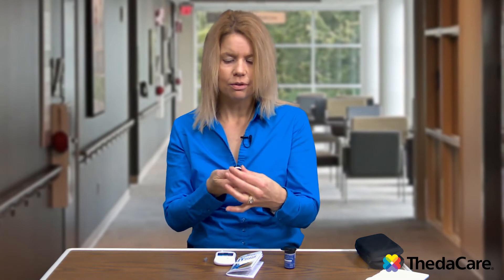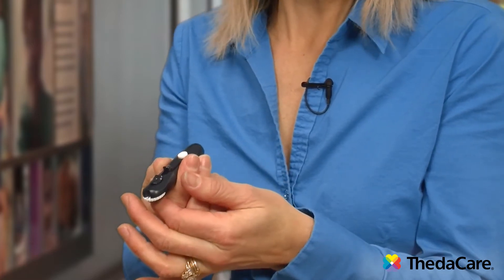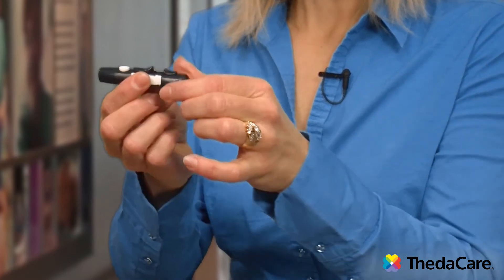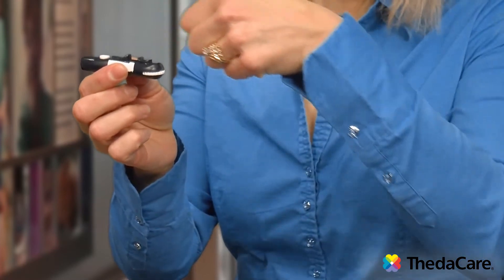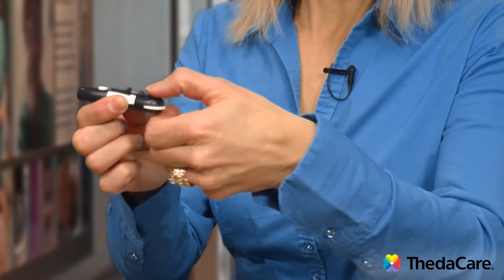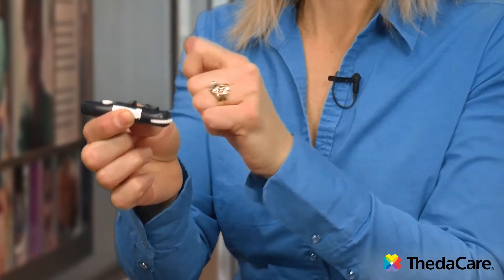If you are new at this and your fingers are pretty soft, you do not need to have it at the highest mark. I would encourage you to put it at the medium — number 2 or 3, somewhere in the middle. On this one I'm going to use 3, because below 3 it usually doesn't poke hard enough. To set up this lancet device, there's a big button on it and you're going to pull that button back until you hear it click. On all lancet devices there is a button that you have to pull to set that trigger.